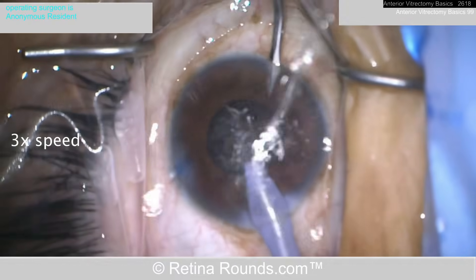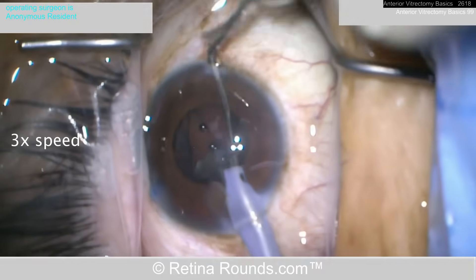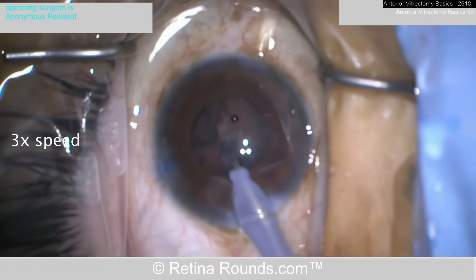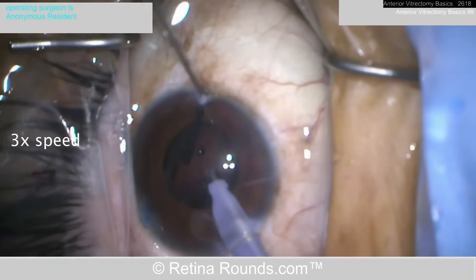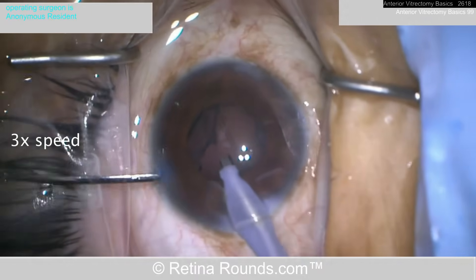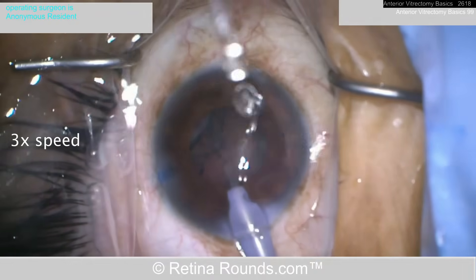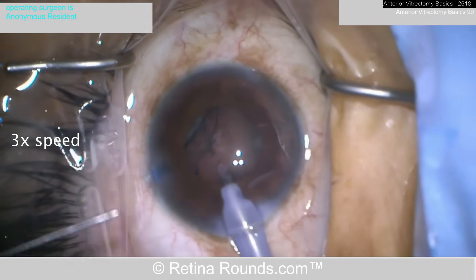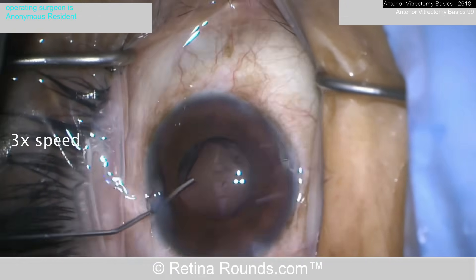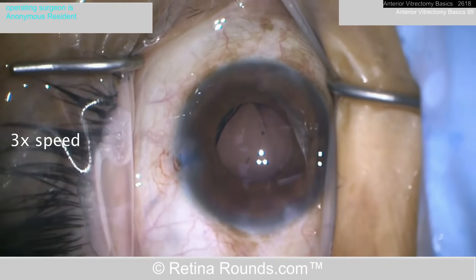Let's see what happens in this case. The anterior hyaloid face has not been violated and vitreous hasn't visibly come forward. The surgical team is mobilizing the residual nuclear fragment up into the anterior chamber so the phacoemulsification probe can remove it — and you can see that goes away nicely. There's still some cortical remnants that need to be addressed. Some dispersive viscoelastic is being injected to push the anterior hyaloid face back and create space between the residual capsule and the cortex.